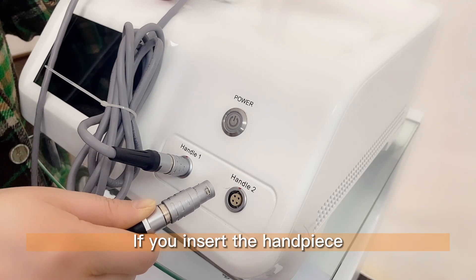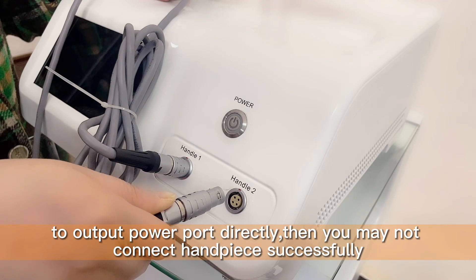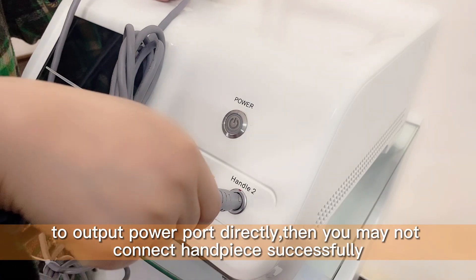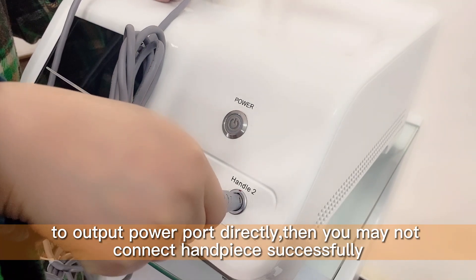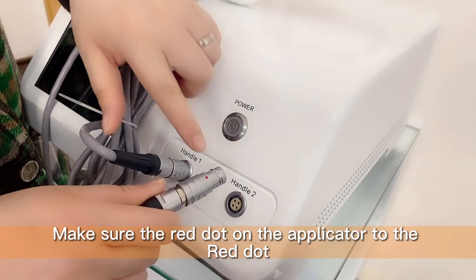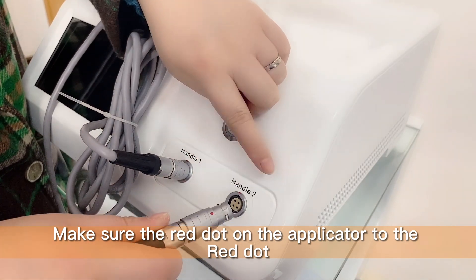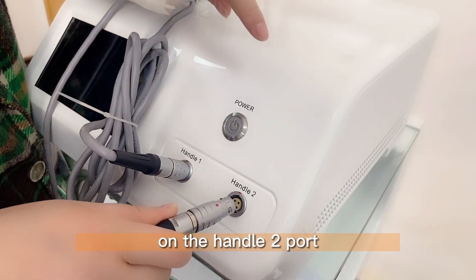If you insert the handpiece into the output power port directly, then you may not connect the handpiece successfully. Make sure the red dot on the applicator aligns to the red dot on the handle 2 port.